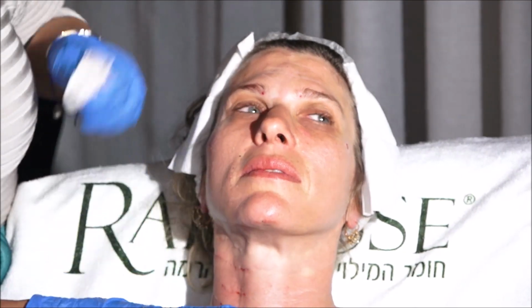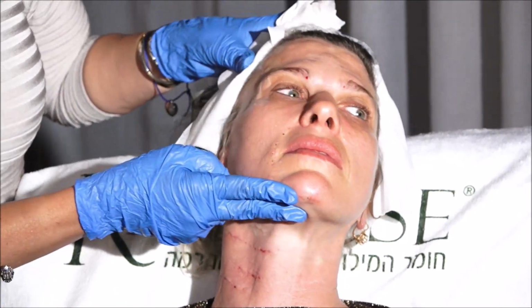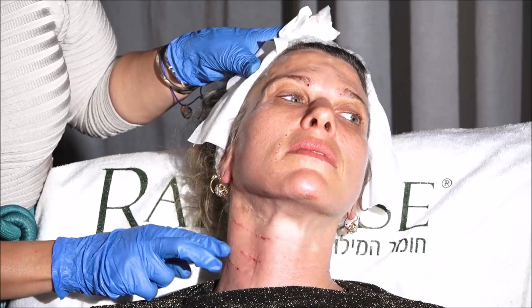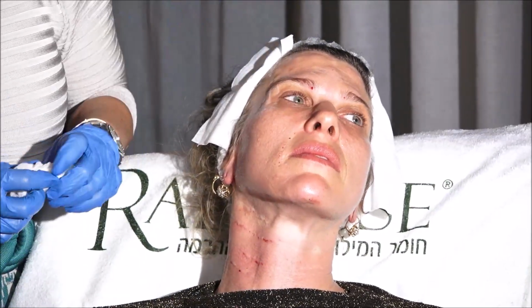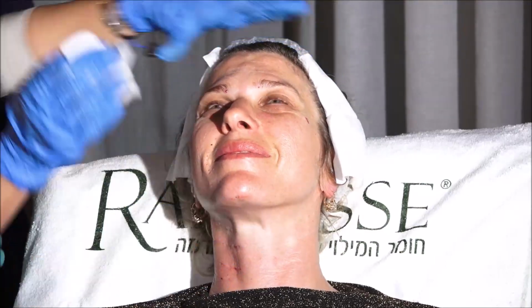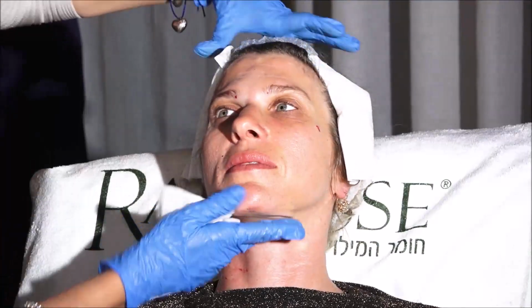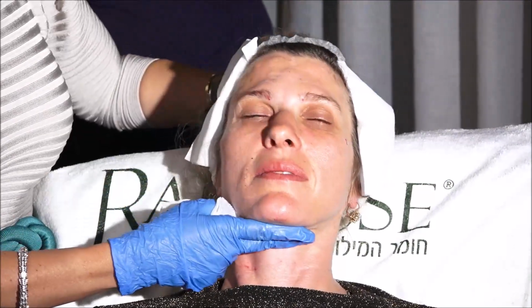For the neck, you see a good correction of the wrinkles already, although it is expected to be better, and the pimples will be gone in 2 days, more or less. You look good. That's it. Okay. I'm just going to do the other side. Yeah, I showed already. She will sit? Yes, you can sit.